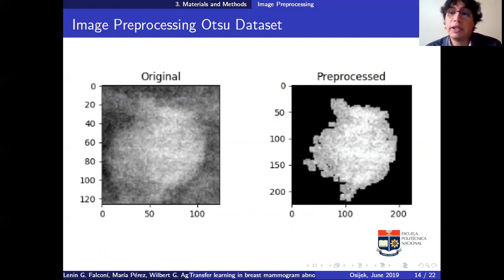an image where we can use auto-binarization as a mask extractor and create this image where we have a black background and the mass is highlighted. So in the research, we were asking, will this be a better image for classification, or will the original CBIS-DDSM dataset image, just with the improvement of histogram equalization, work better?